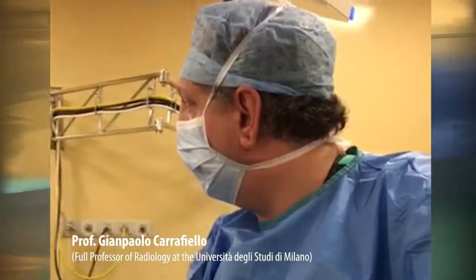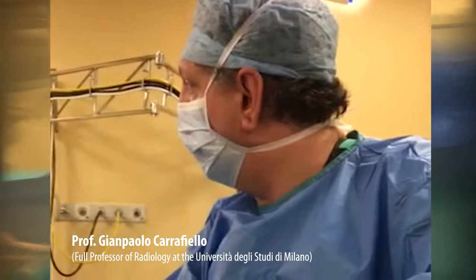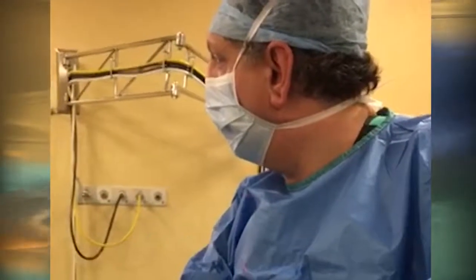L5 levels. The hernias will be treated using DISKOM device, consisting of a trocar-tipped access needle and a screw-tipped stylet that makes it possible to remove material from the nucleus pulposus. The first step consists in accessing the disc using a very simple procedure.